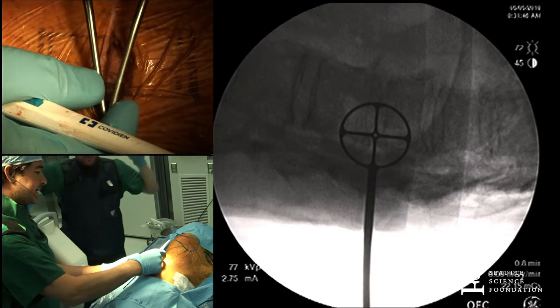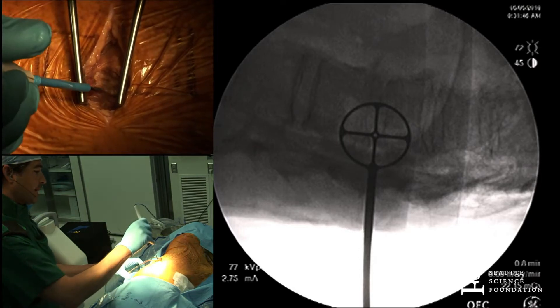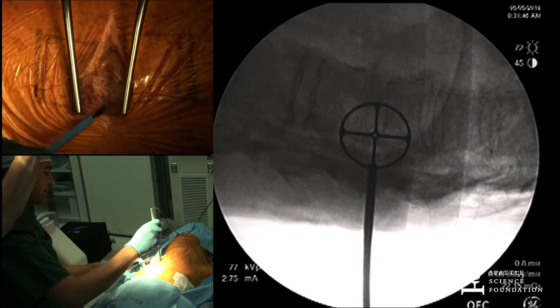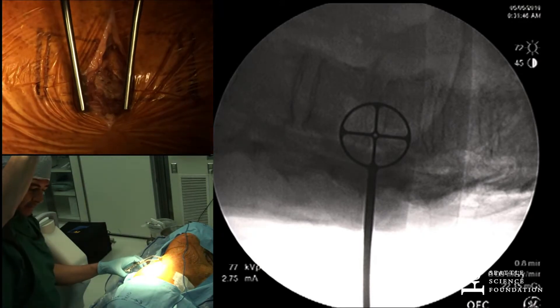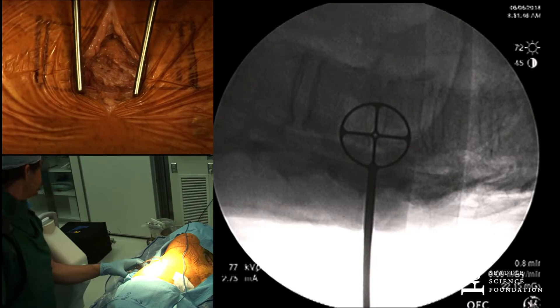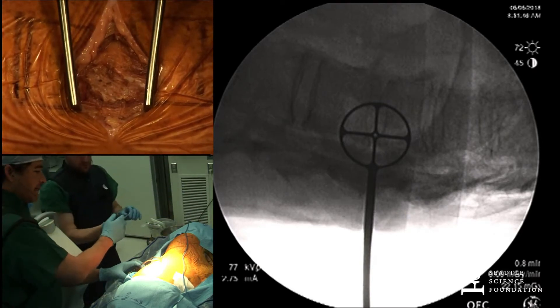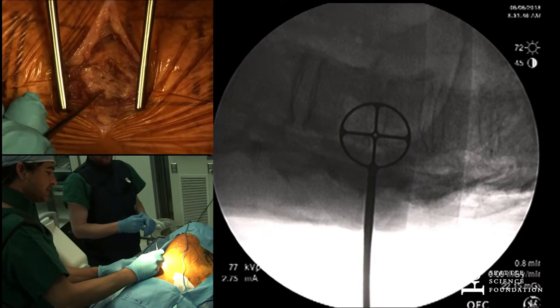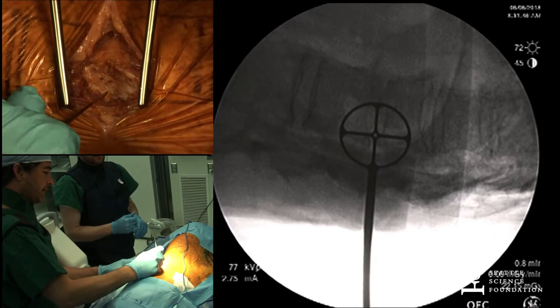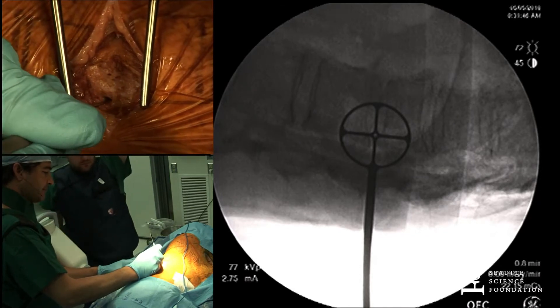As you know from the anatomy, the rib head will take you to the transverse process, and that'll take you to the neural foramen, so it'll take you posteriorly. There's the rib right there. Normally what I do is find the rib and then nicely retract all the muscles around it and dissect.